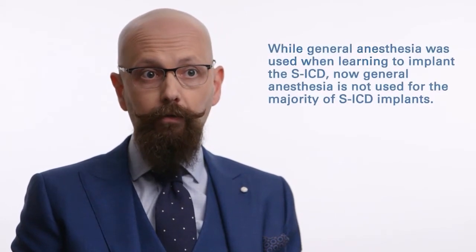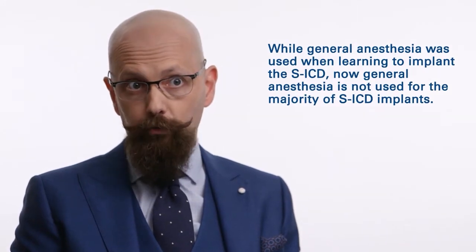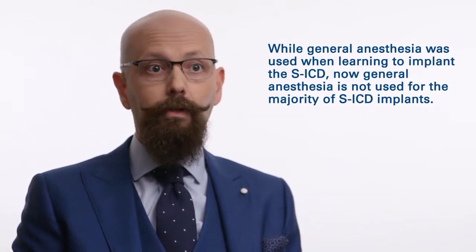I used anesthesia exclusively for the first 20 cases with a general anesthetic, and that was mostly for my comfort level and having to not worry about sedating the patient and performing the procedure at the same time. Now the majority of these we don't involve anesthesia with. I'm doing the sedation. I do have deep sedation privileges at our institution, which helps immensely.